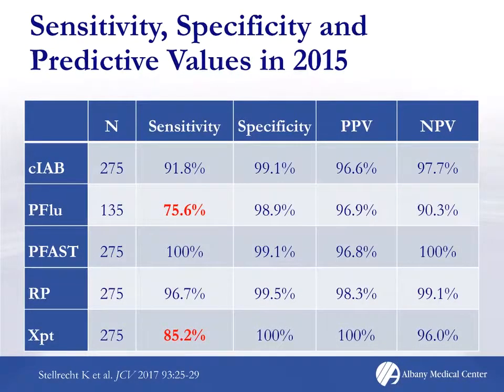But it ended up being important, as we later learned, that with the viruses circulating in our region, for that 2-week period of time, the ProFlu assay only had a sensitivity of about 76%. And also the Xpert assay had reduced sensitivity.